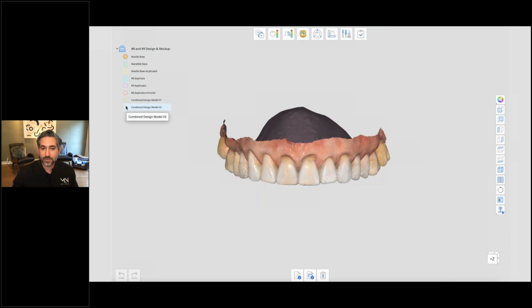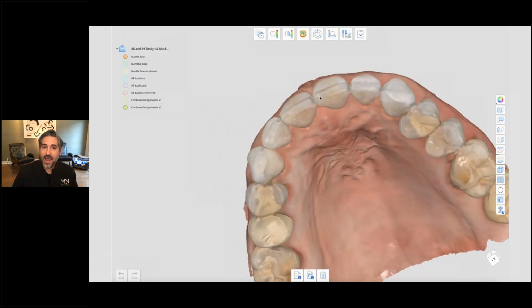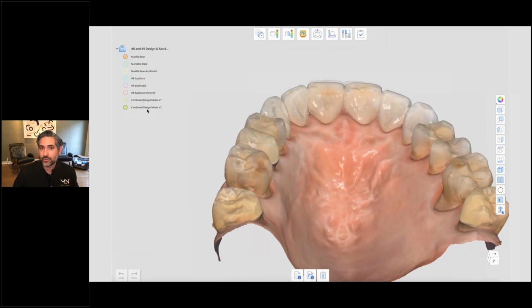I transformed to make them longer. And then I added just a little bit of volume in the cervical. And I was able to get a design where we're adding just that little bit of length. She didn't expect too much. She knew that we really can't add too much length or we're going to have an awkward contour or situation, but to her it was important to get that.